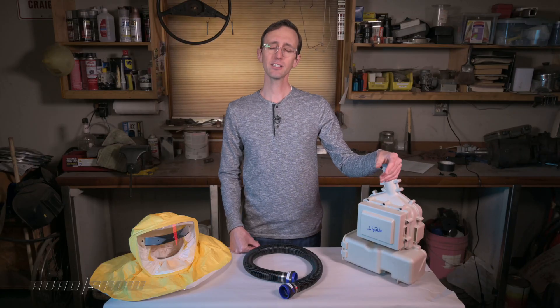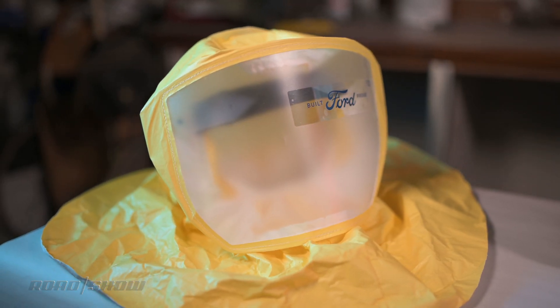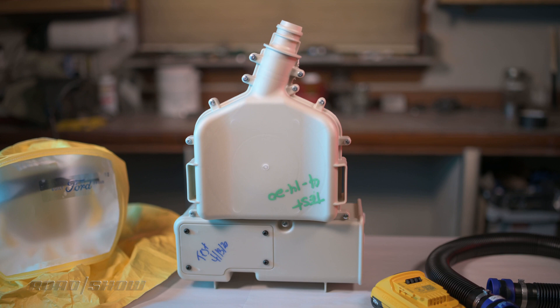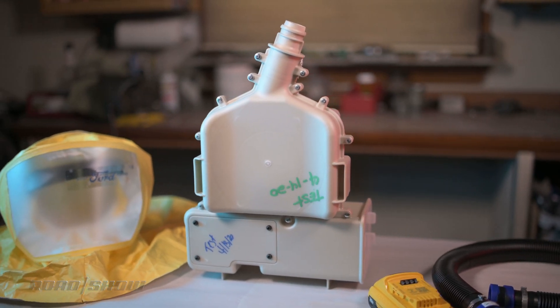So what exactly does a PAPR do? They're designed to provide the wearer with a stream of filtered air delivered under positive pressure to protect them from contaminants. Obviously, in this case, the system is intended to prevent the spread of infectious disease, but respirators like this one do have uses in other applications — they can be worn while painting or welding to protect against noxious fumes. But Ford's design here is only intended to be used against the coronavirus.